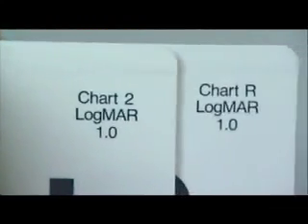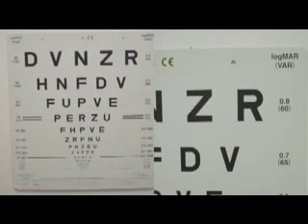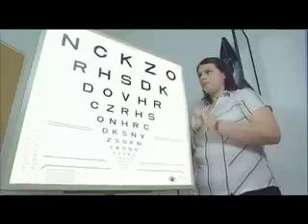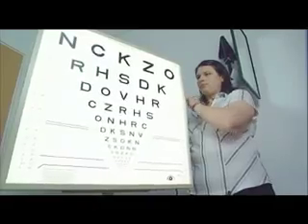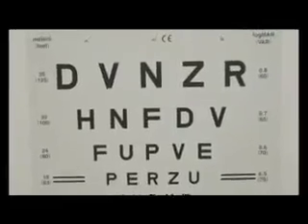LogMAR stands for the log of the minimum angle of resolution. The chart displays a limited number of Sloan letters selected for their visibility, which diminish in size from above downwards in logarithmic steps from row to row. Each row consists of five letters, giving the chart a distinctive V-shape. The Snellen equivalent of each line is indicated opposite the LogMAR value.